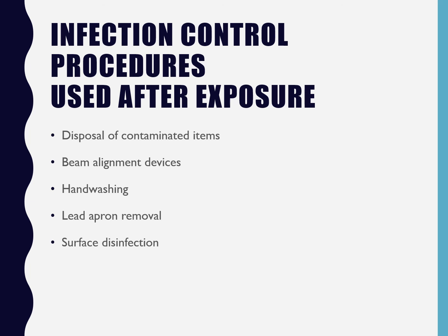Then you'll process your films after you would have already cleaned your room, because the next person might need to use that room while you're processing films. Or you might even convince the rotator to process those films for you, which would be nice. Or, clean the room too.